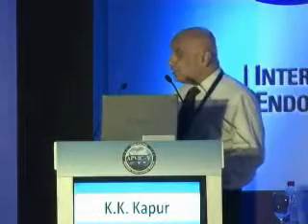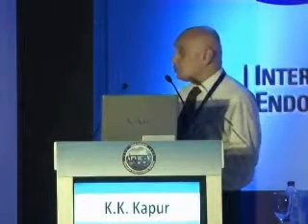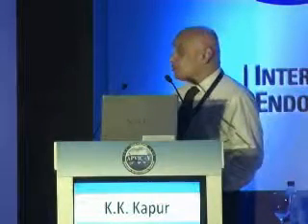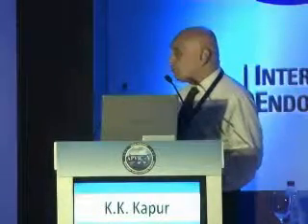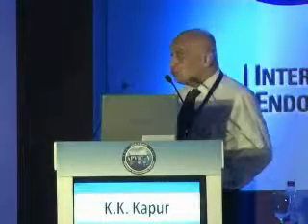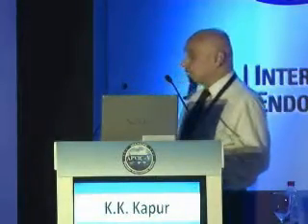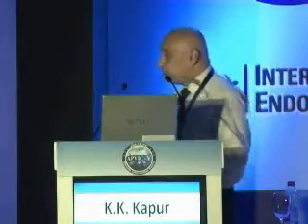You can get an incomplete color fill-in, or you can get a complete absence of color or flow or spectral Doppler flow, spontaneous, and there is of course impaired or absent augmentation of flow. But having said this, it's important that if you do get a reasonable augmentation, it does not always exclude a DVT. Lack of spontaneous flow and increased flow in collateral channels.